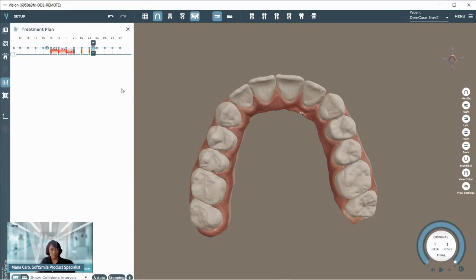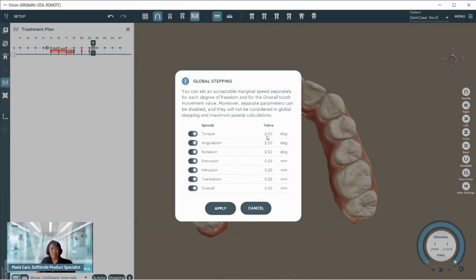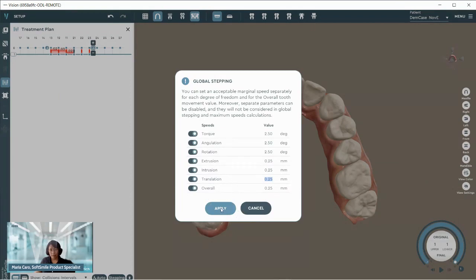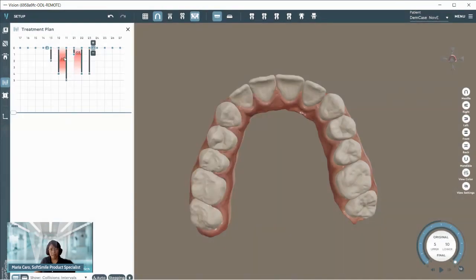To generate a treatment plan, go toward the bottom of the staging table and select Stepping. Here you place the value of speed at which you want specific movements to be executed — this is where you decide how aggressive or passive you want to be. Each cell is active so you can enter the value for each particular movement. Click Apply, and as you can see, a sequence has been created for the upper and a sequence has also been created for the lower.